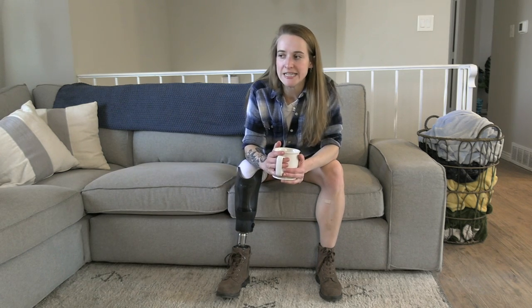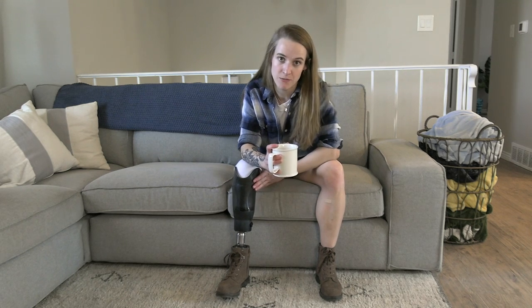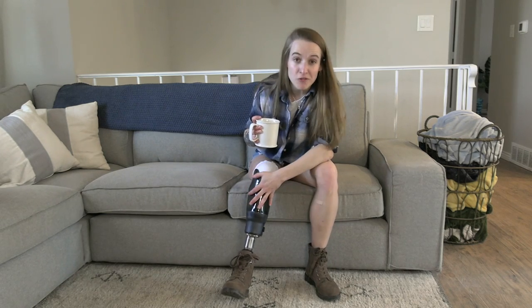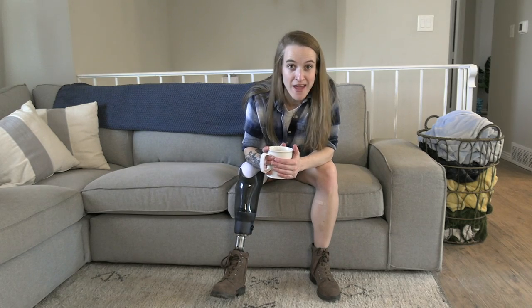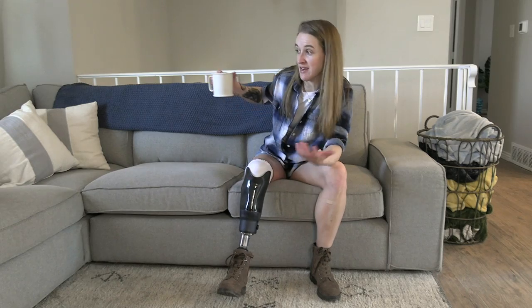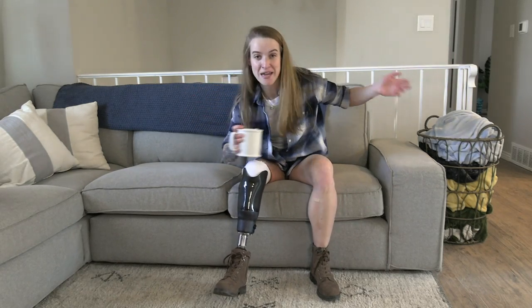But overall, I'd say it feels pretty much the same as the suction system I had, which I kind of count as good news, honestly, because if this leg can work for me, it gets rid of the anxiety that the suction is going to randomly fail if I'm grocery shopping or traveling, or my sleeve's going to get a hole and now I don't have a leg. And is insurance going to pay for it? Can they ship it in time? Will I not be able to walk for days?